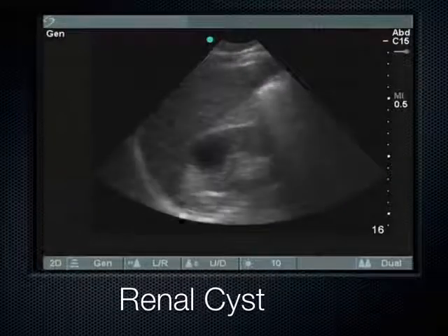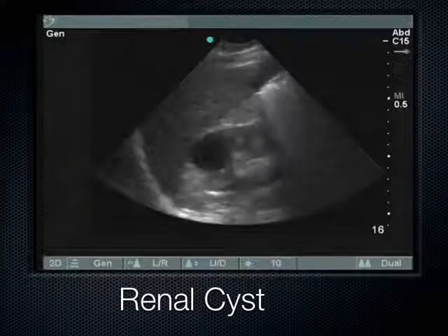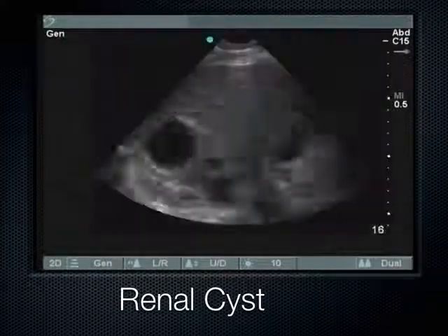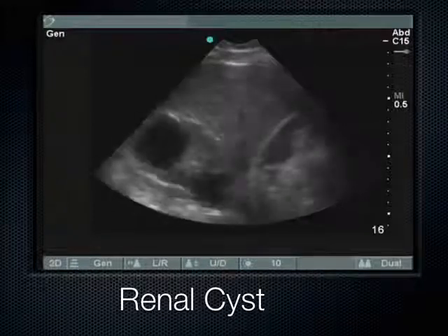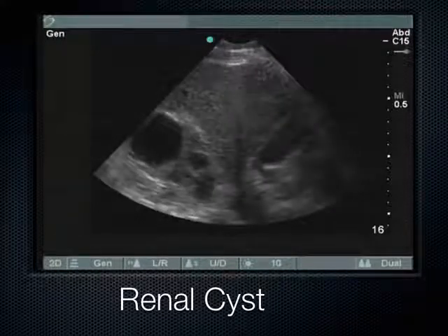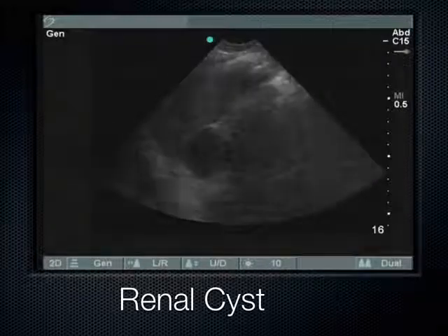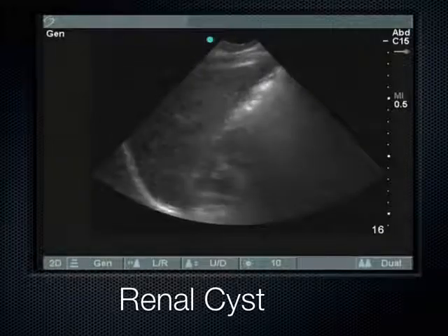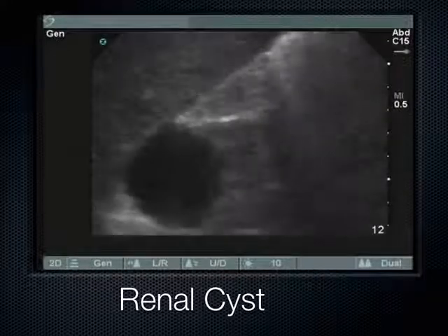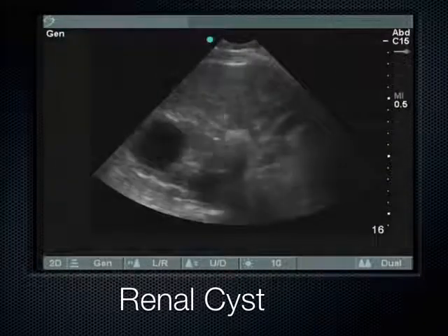This is an example of a renal cyst — notice it's out in the cortex of the kidney. Here's the liver, here's the kidney. We're losing the lower pole from bowel gas, but we can see a cyst up here and another little cyst down here. No matter how you rotate the probe from transverse to coronal, the cyst is always spherical and anechoic in all planes.